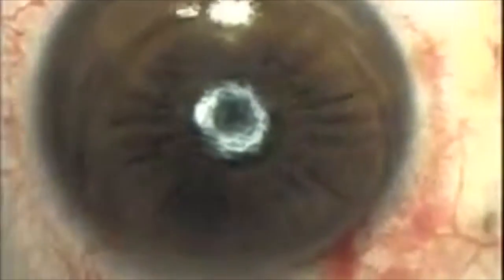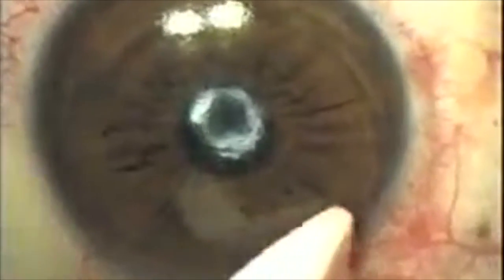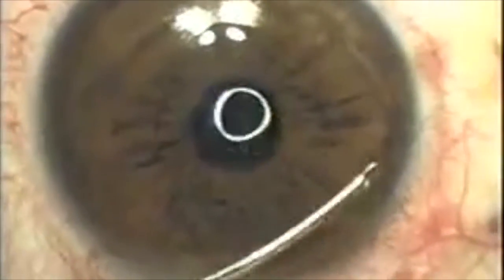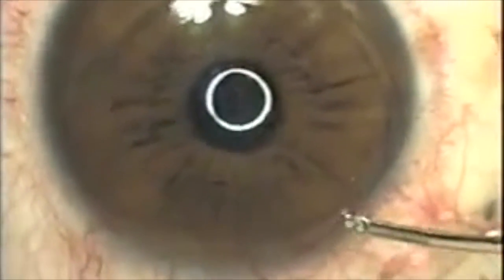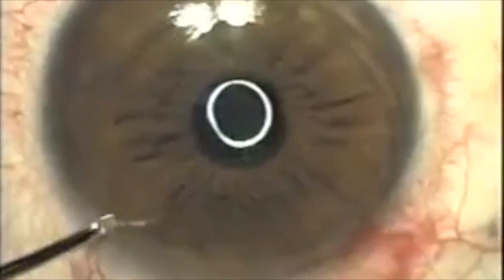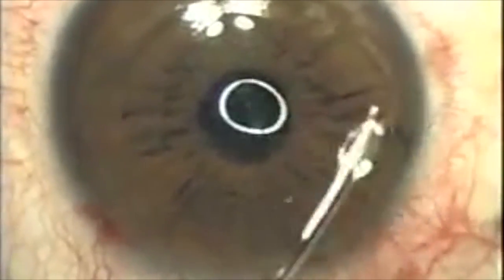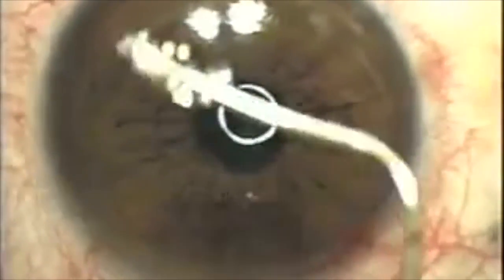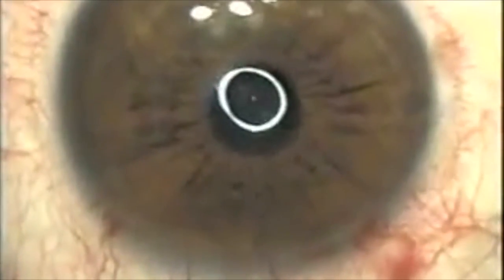The surgeon is now just making sure that there aren't any air bubbles in between the corneal flap and the stroma. That would cause irregularities or complications in the future. So functional vision should return the night of the surgery or the day after, and follow-up visits are dispersed throughout 1 year at increasingly long intervals.